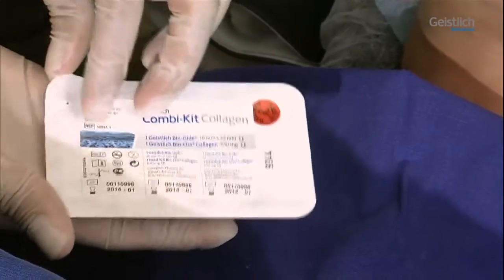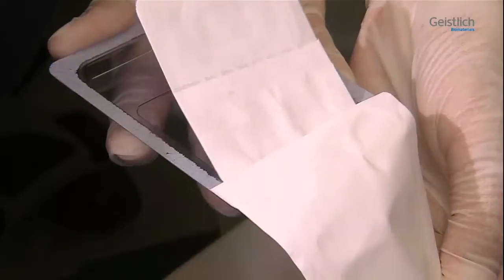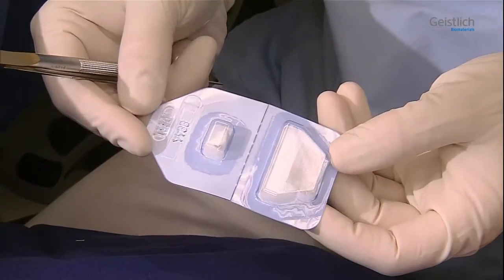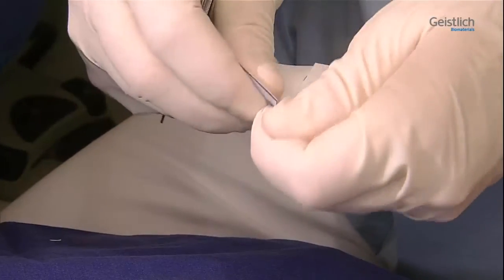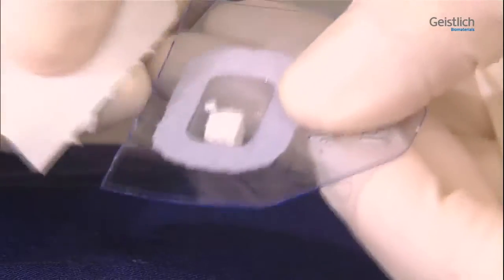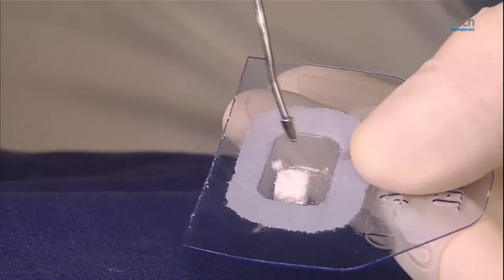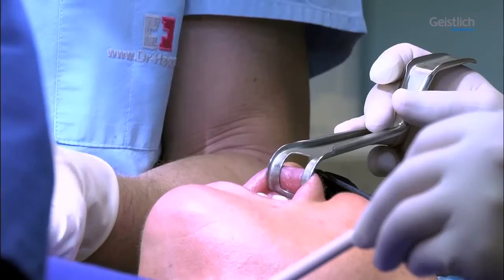The Geistlich Kombikit Collagen consists of a 16 x 22 mm Geistlich BioGuide Collagen Membrane and a 100 mg Geistlich Bio-Oss Collagen Block, which are individually packaged in sterile blisters. The Geistlich Bio-Oss Collagen Block absorbs liquids well. Both products should be used together in the same procedure. The collagen membrane has two sides, which are differently structured.